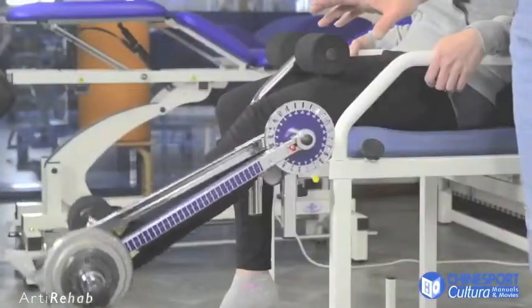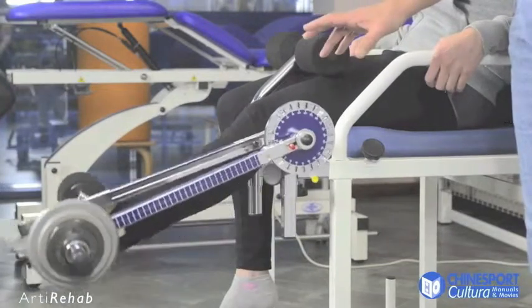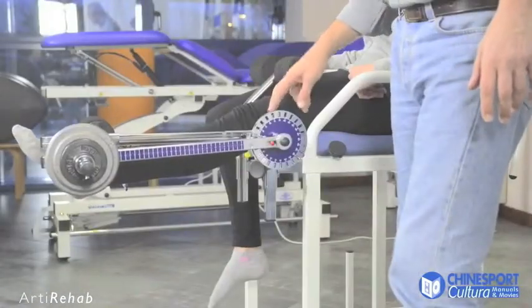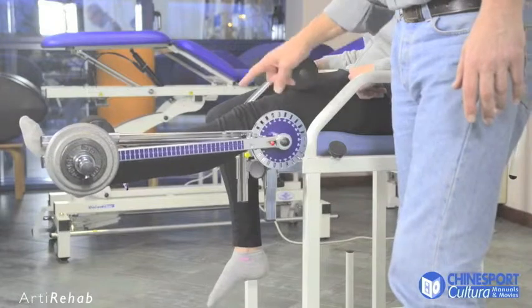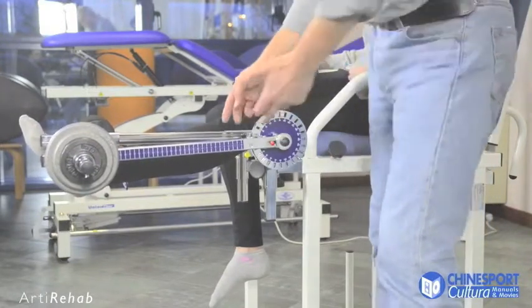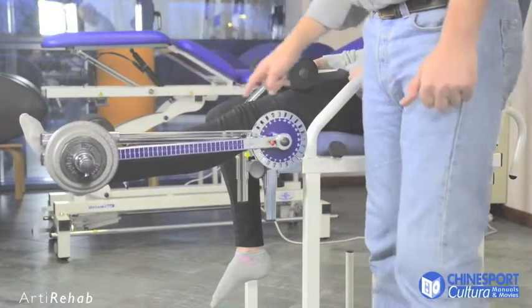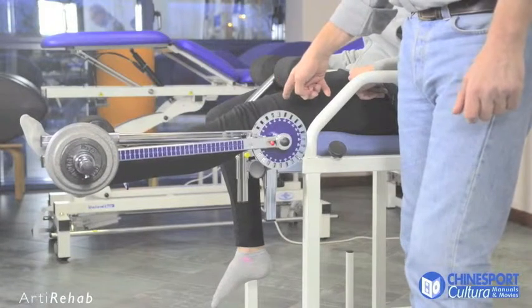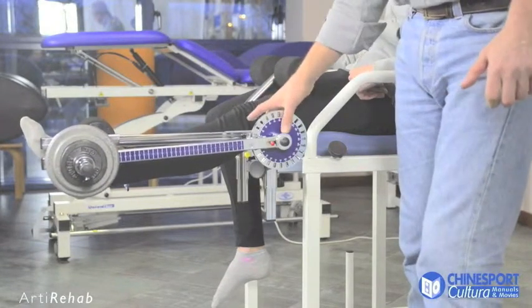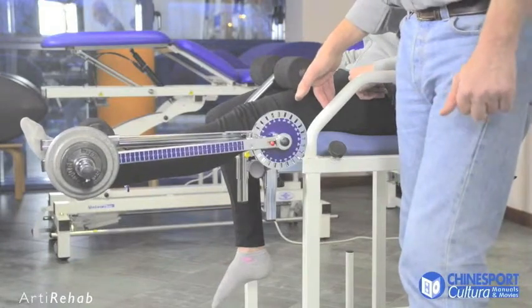It is also possible to vary the exercise by doing a purely isometric contraction. To do an isometric exercise using Arty Rehab, the machine has to be adjusted to position the loading arm parallel to the thrust arm. In this case, the patient does the isometric contraction without mechanical effort, but only by means of physiological work done by the extensor muscles.